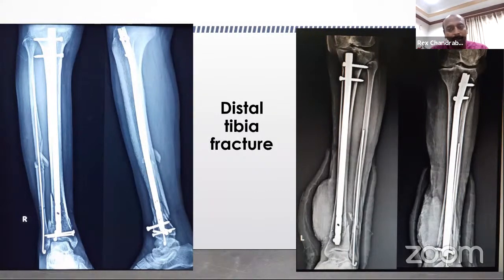For the minimally displaced fractures, you fix them first, using small K-wires or some cannulated screws, small size screws, so it doesn't jeopardize the passage of the nail. And then you lock the nail, and you may get 1 or 2 screws at the maximum. So this is minimally invasive and you respect the soft tissues around. This leg was so swollen, and this is patient friendly, rather than putting an external fixator, it's really patient friendly and also a very biological type of fixation.